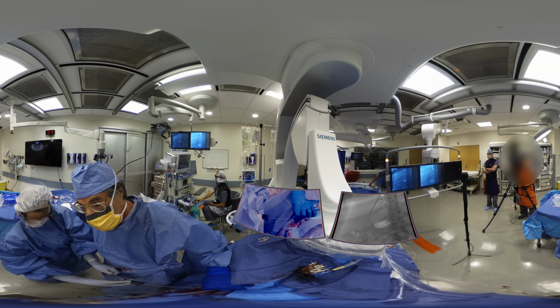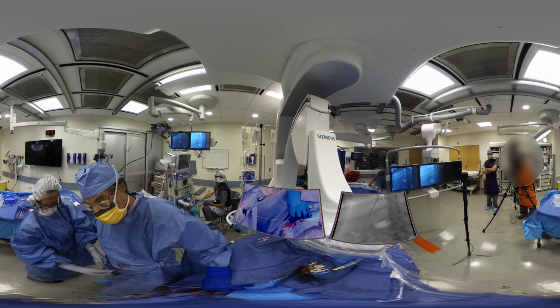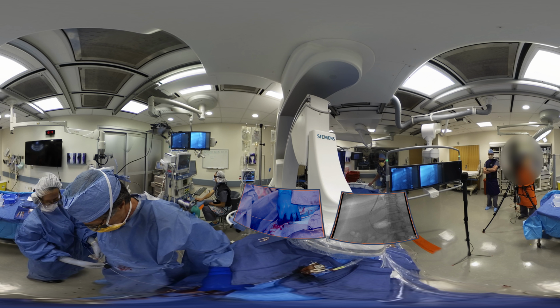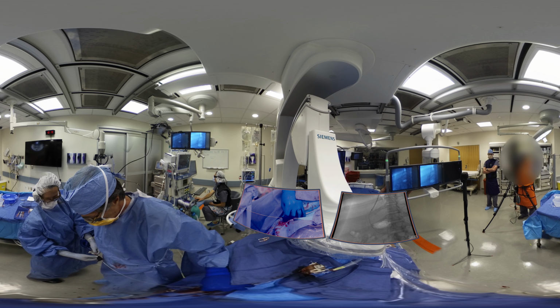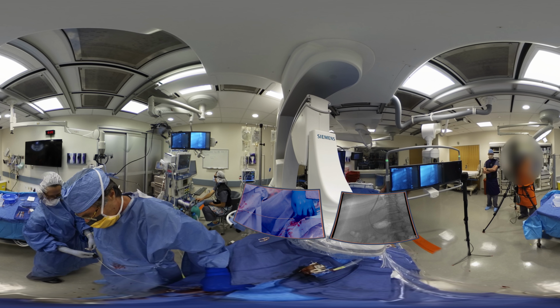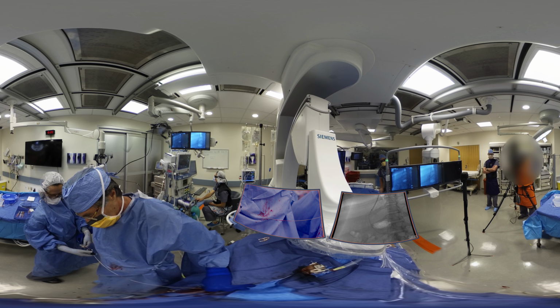Guide wire is in place, and the most important thing that I can be doing here is keeping the sheath pushed down. I can't emphasize that enough. So that's rule number 2, keep the sheath down. In this case, it's pushed up against the portal vein entry site. We're taking our time. The wire hasn't moved a stitch. Next thing is to make sure that we don't cut a finger as the needle emerges and that the wire doesn't slip back. Starting to release.